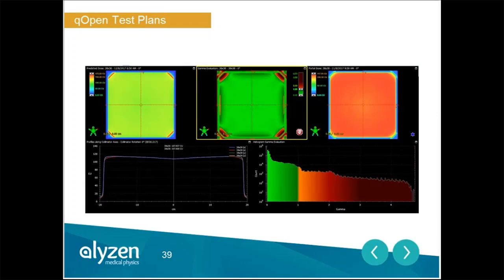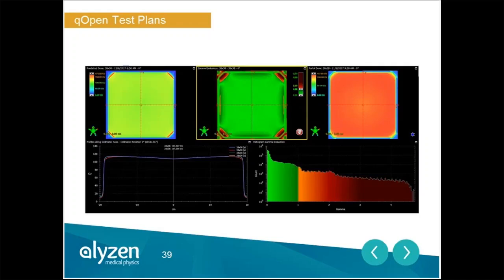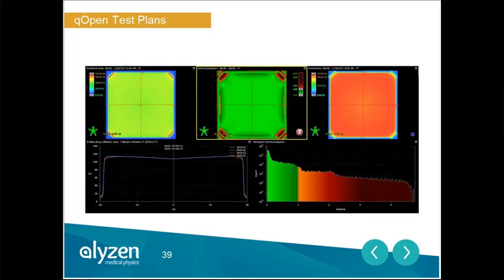For typical fields, for typical IMRT QAs, you know, prostate plans, for example, you may not see a difference in your IMRTs between the two intensity profiles used here and used here. However, maybe a large field pelvis using much more of the panel is going to give a much different response if you were to use this intensity profile versus this one. So that's one of the major trip-ups that you can run into. Just need to be aware of it and be aware that you can change that intensity profile. You can play with it a little bit and come up with a solution here.